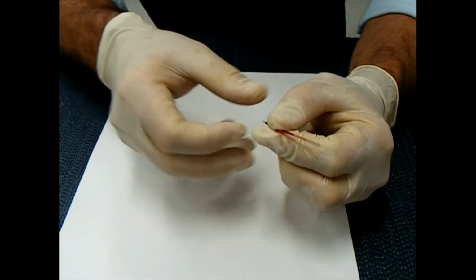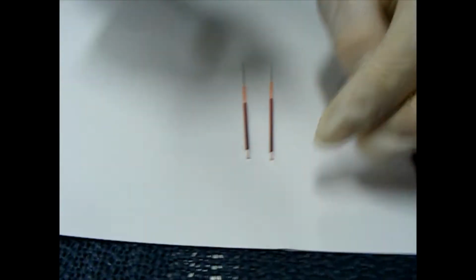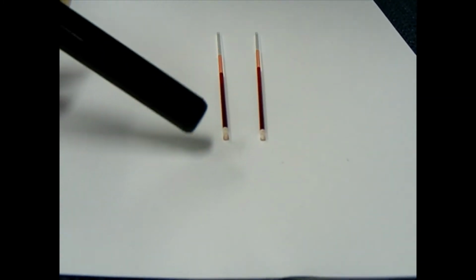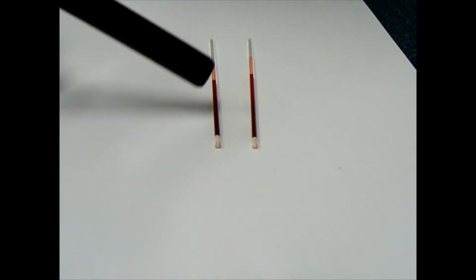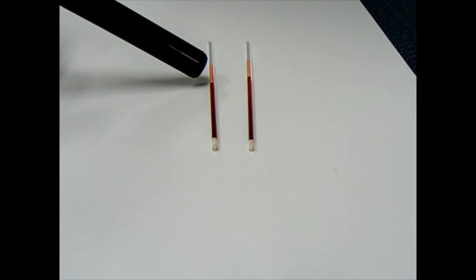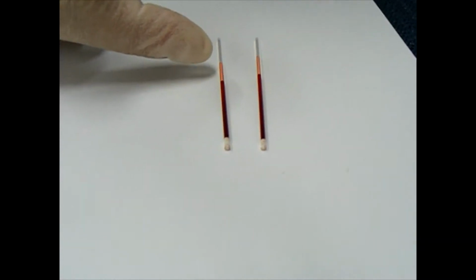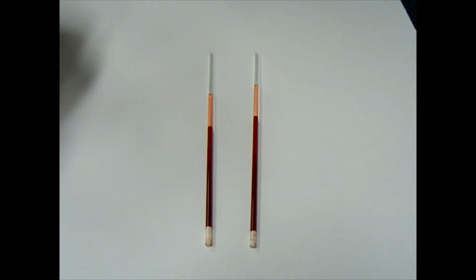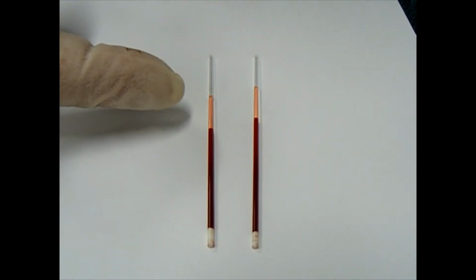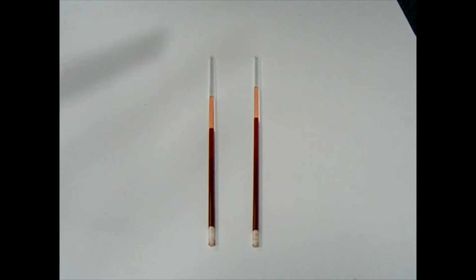Okay, I've got my 2 capillary tubes and I've taken them out of the centrifuge, and this is what they look like. So you can see the plug on the end has stayed intact, which is good. If that comes out, blood tends to go all over the centrifuge, which is not good. You can see the red blood cells have been packed down the bottom, and then above that is the clearer plasma. Now this is hemolyzed a little bit. You can see the colour there, it's not clear. You can get white lipemic plasma or serum, you can get yellow, or you can get hemolyzed, which is a bit red stained. So we've got enough here to do a PCV.